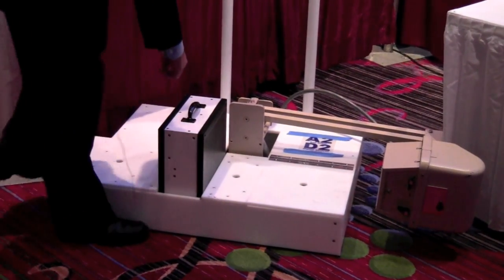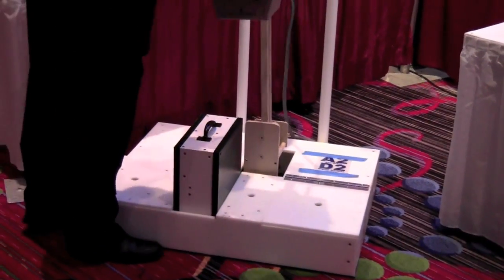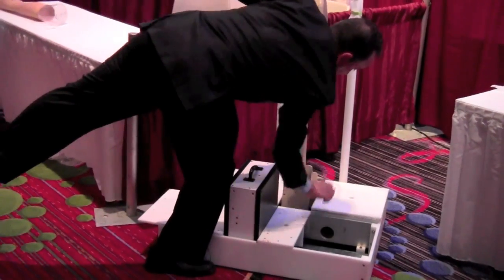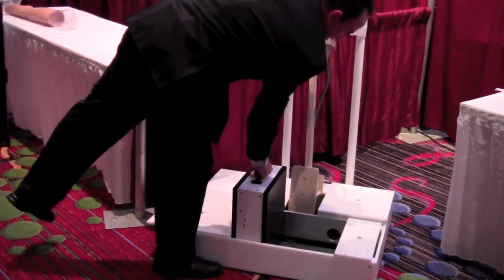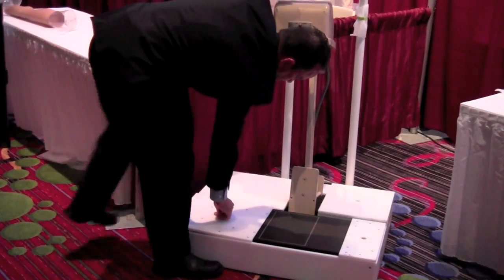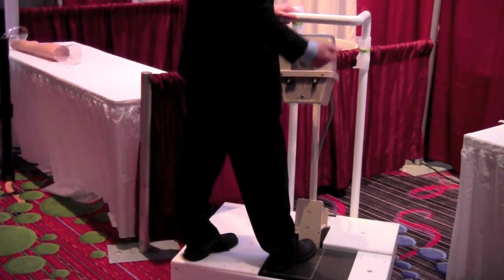While it's processing the image, I'm going to transition over to an AP shot. We simply flip this panel up, slide this over, and transition the imager down into a horizontal position. And now we're ready to take the AP shot — pull the trigger.